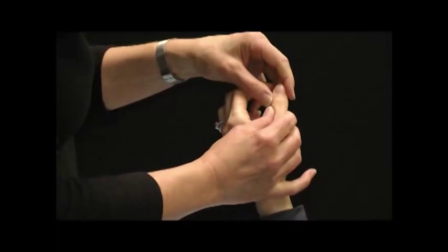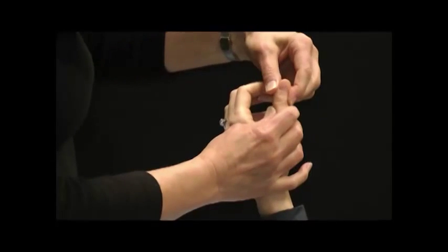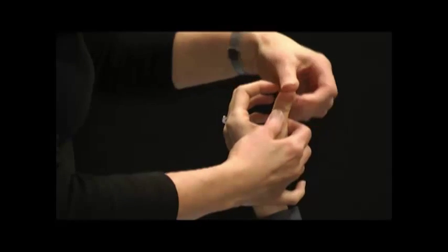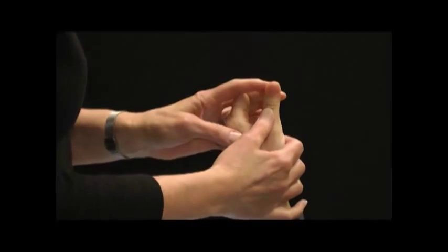Does she have any pathology here? She's solid that way, that way, solid that way. How much does she flex? Does she hyperextend? Okay, so she hyperextends normally.